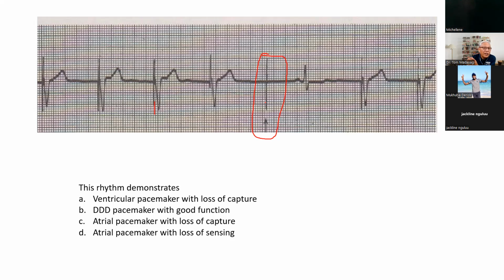And therefore, in the event that you see frequent loss of capture, it needs to be reported to the physician because the amperage or the amount of electrical current necessary to produce a response needs to be adjusted.